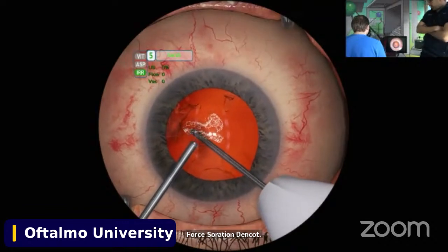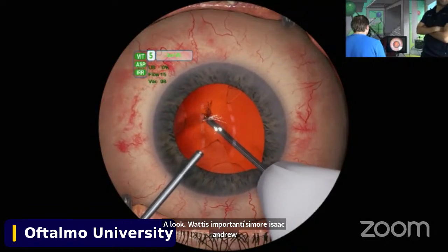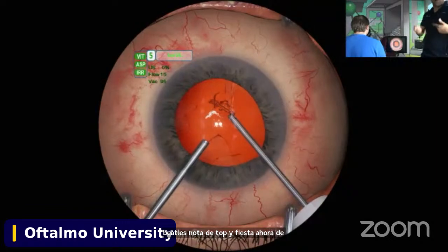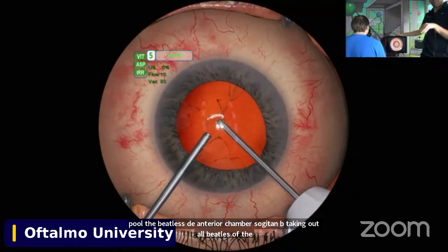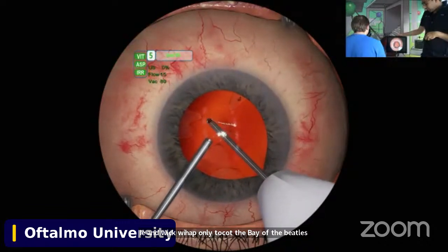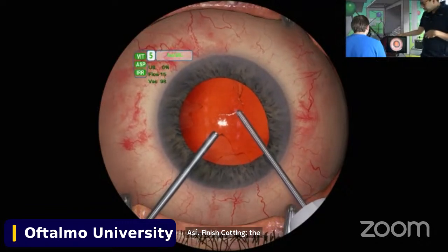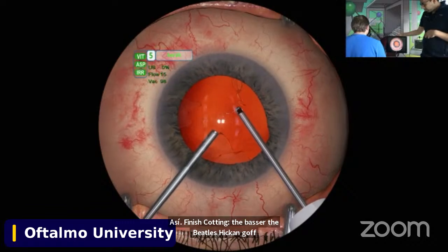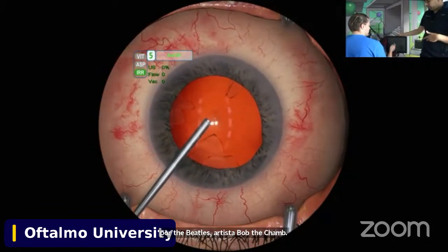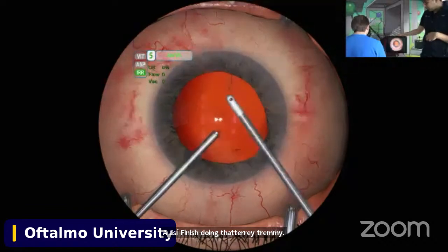And look, what is important here is that Andrew started the anterior vitrectomy at the bottom of the vitreous, not at the top. If he started at the top, he would pull the vitreous to the anterior chamber, so he could end up taking out all the vitreous of the eye. And we have only to cut the base of the vitreous. As he finished cutting the base of the vitreous, he can go for the vitreous that is above the chamber. And as he finished doing the anterior vitrectomy, he can now go for the remaining cortex.